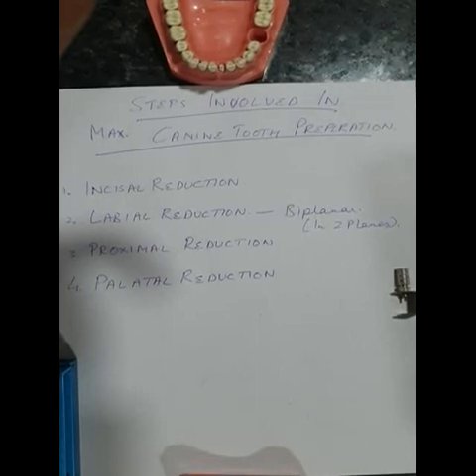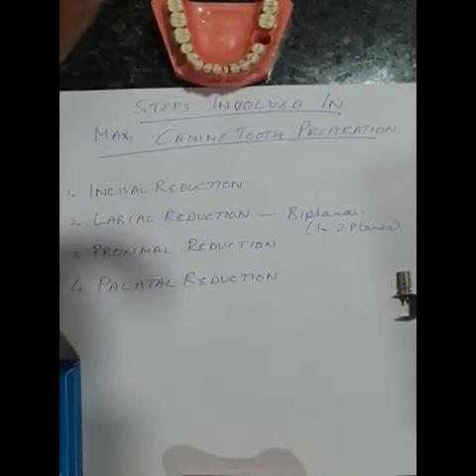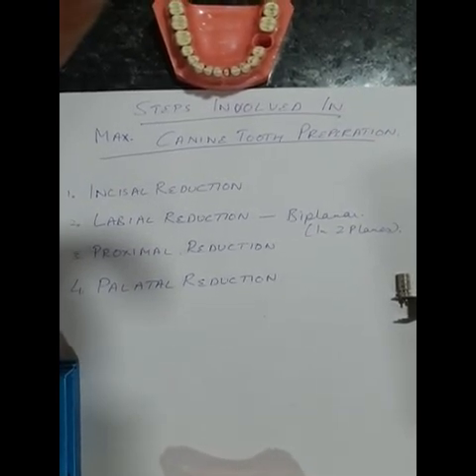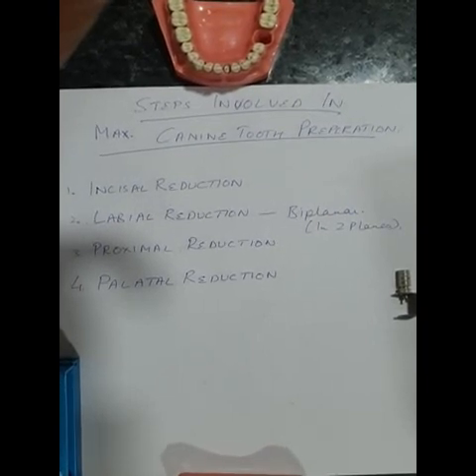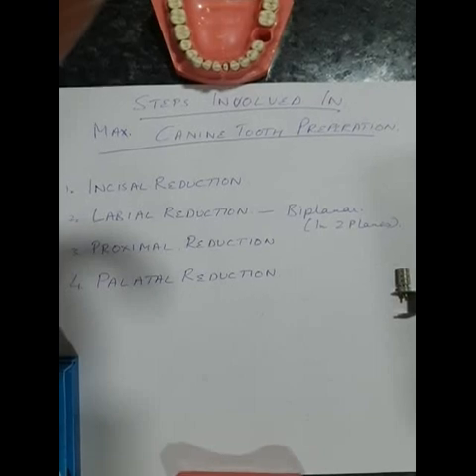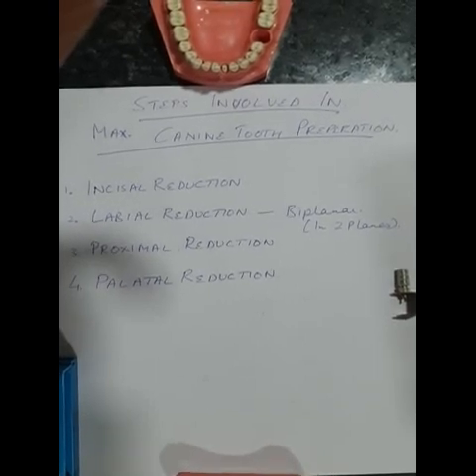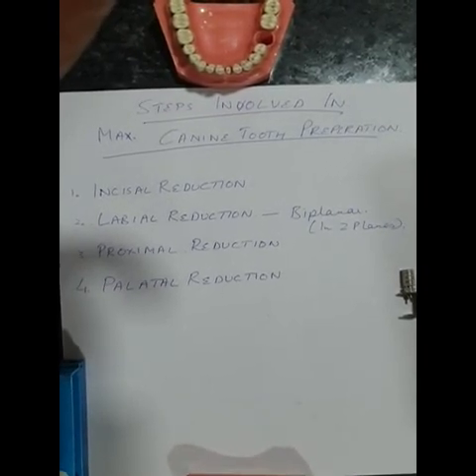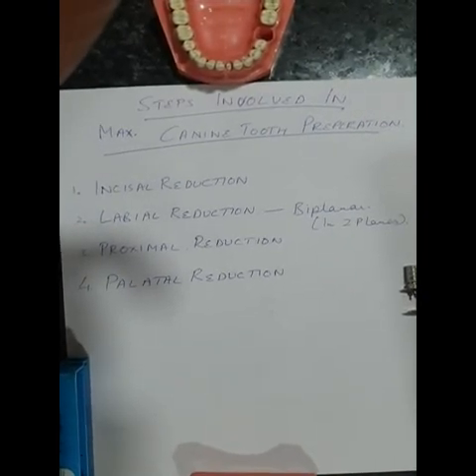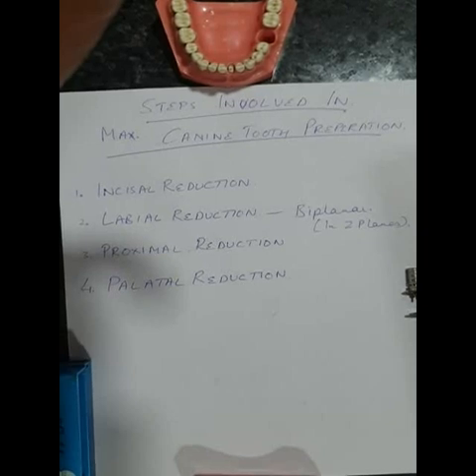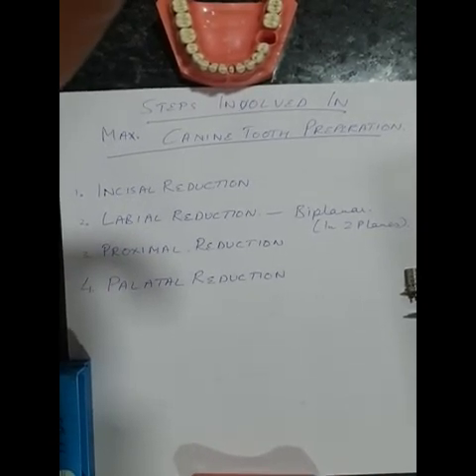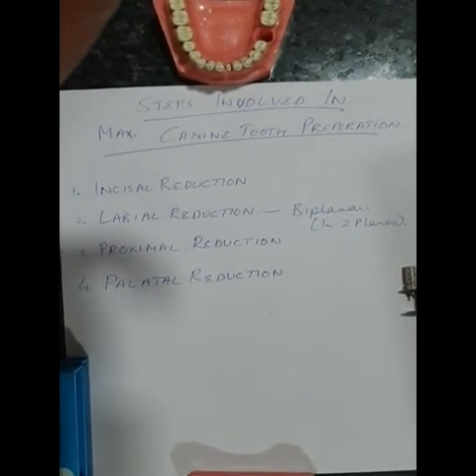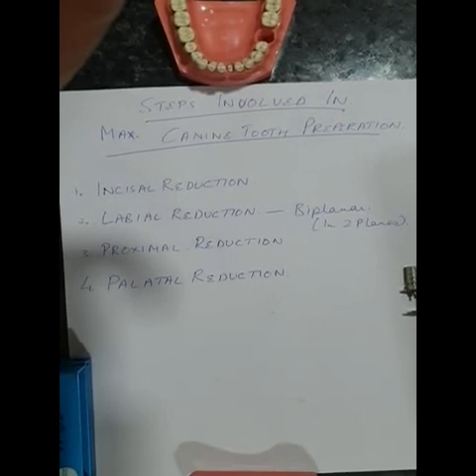Once you have completed the labial reduction, then comes the proximal reduction. For proximal reduction, you use a long needle bur or a contact breaking bur to remove all the proximal contact areas and break contact with the adjacent teeth. You should always try to leave a lip of enamel in contact with the adjacent teeth while doing reduction with this long needle bur. Once you have achieved the separation, there will just be a thin lip of enamel touching the adjacent tooth.